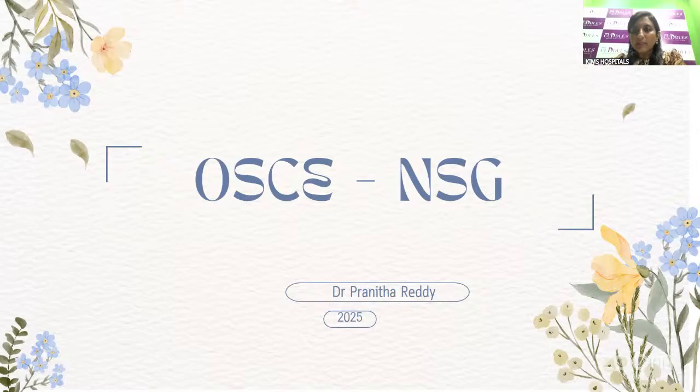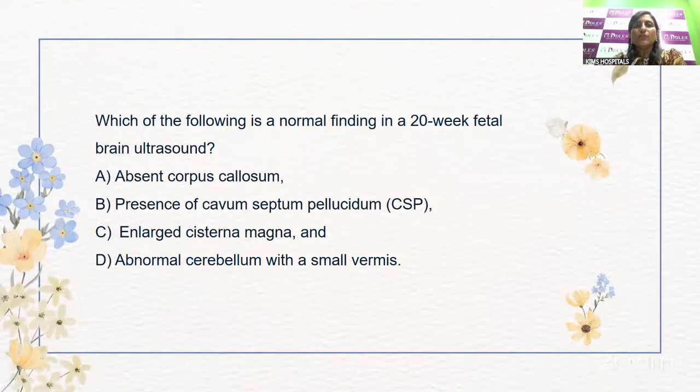Good afternoon, everybody. I'm Dr. Pranitha, consultant neonatologist, Cuddles. Today in this session, let's discuss some commonly asked OSCEs in neurosonogram for fellowship exams. So coming to the first question, which of the following is a normal finding in a 20-week fetal brain ultrasound?